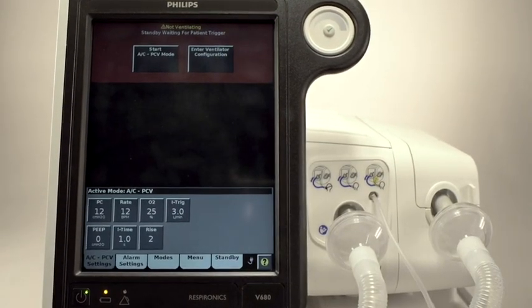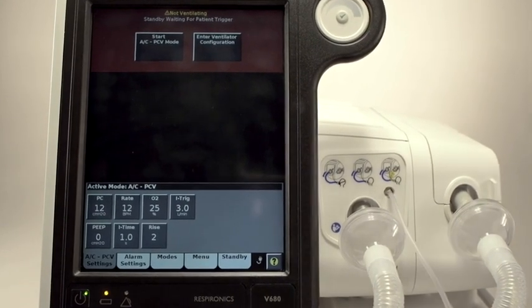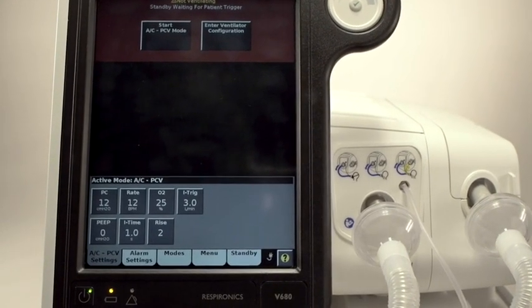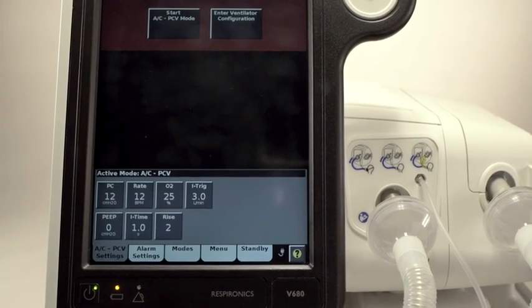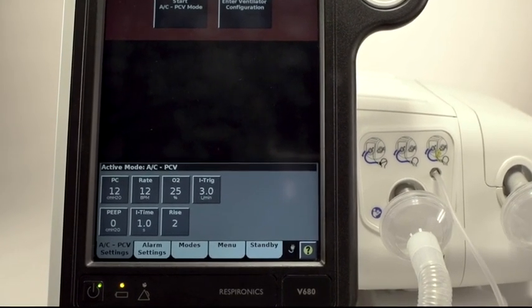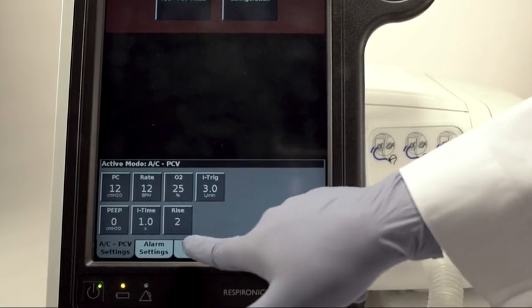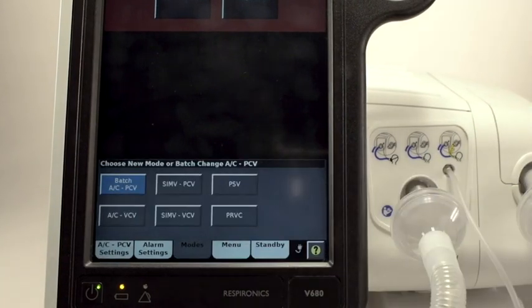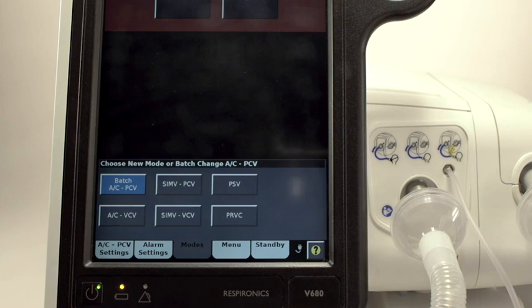We can either start immediately with the default mode in Settings, or we can select a new mode in Settings. As before, we can also tweak any alarm setting prior to activating ventilation. Touch the Modes button. You can see that the available modes have changed for Dual Limb Invasive Ventilation, Assist Control Pressure or Volume Ventilation, SIMV Pressure Control or Volume Control, and Pressure Support and Pressure Regulated Volume Control, or PRVC.